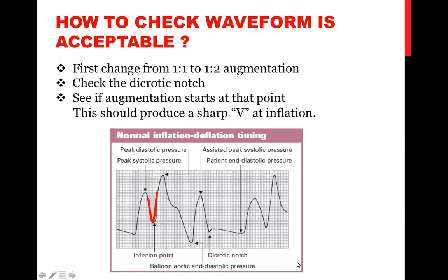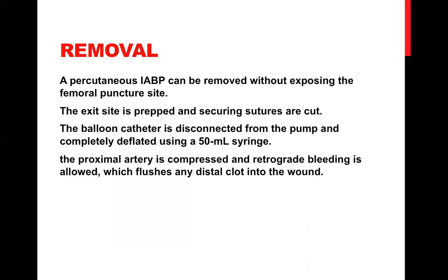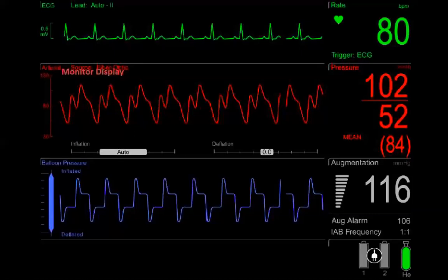Now you saw this graph. You saw the patient put in 1 to 2. Go to the monitor, please. And the monitor still shows the same numbers. صح يا حسين هذا سؤالك؟ صح. Assuming, of course, the graph is what we saw earlier, اللي هو 1 to 2. But the numbers did not change. How do you explain that?